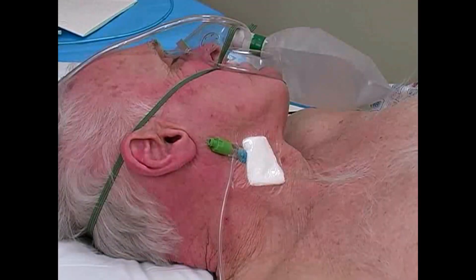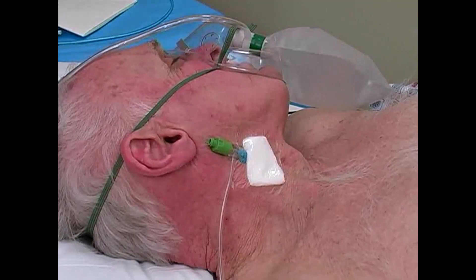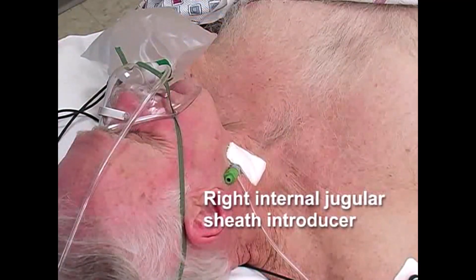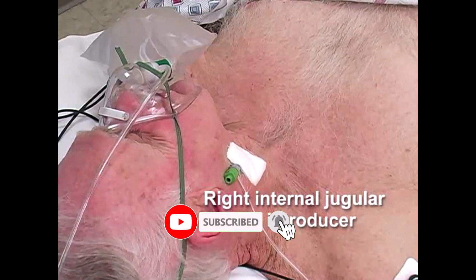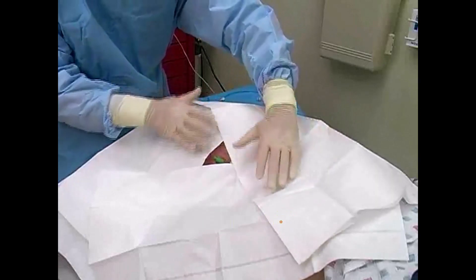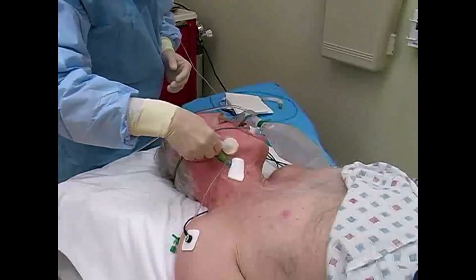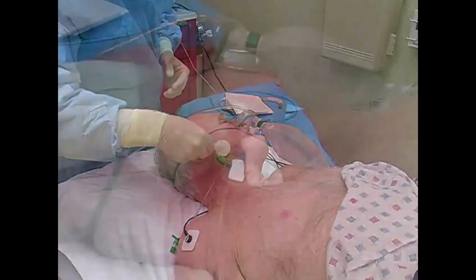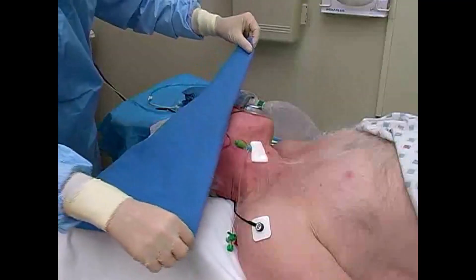Prior to insertion of the transvenous pacemaker, a central venous sheath introducer must be established, preferably in the right internal jugular or left subclavian vein. Ideally, the pacemaker will be inserted while the sterile field from the line insertion is still intact. If not, the catheter hub and surrounding skin must be prepared with antiseptic. Place sterile drapes broadly around the central venous access site.